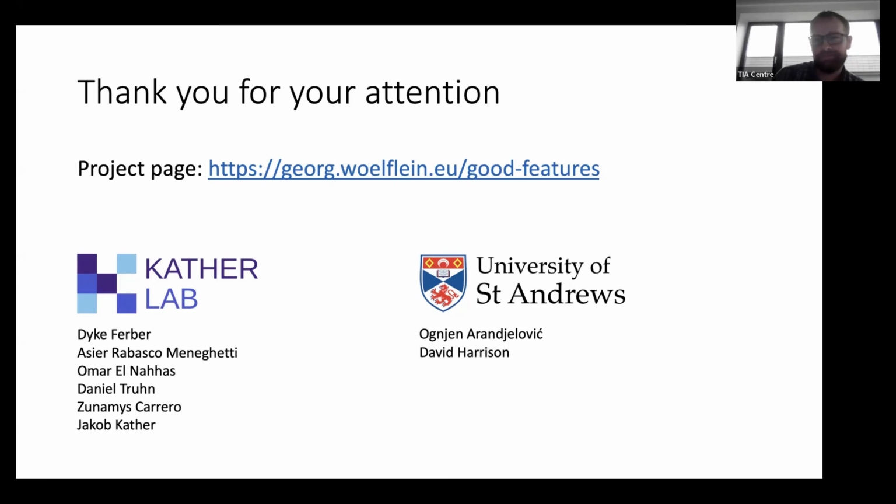Quick one. Given the added complexity that doing stain normalization adds to pipelines, in light of your results, which say it makes very little difference, would you say you can suggest that perhaps leaving that out of your machine learning pipeline is actually a good idea? Yeah, I mean, that's what I was trying to say. I didn't talk about the computational overhead, but yes, it's significant.